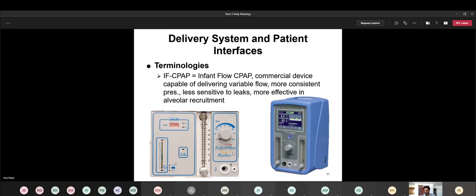And then this over here, I just included this as another type of infant flow CPAP system. It's called the SiPAP. And Si is just a shorthand way of saying sigh, like S-I-G-H, take a big breath. And with the SiPAP, it's kind of like BiPAP, kind of. You have to set 2 pressures in SiPAP. And then, depending on how many sigh breaths you want the machine to generate, it'll send the baby up to about, like right here, it looks like they've got 6/4.